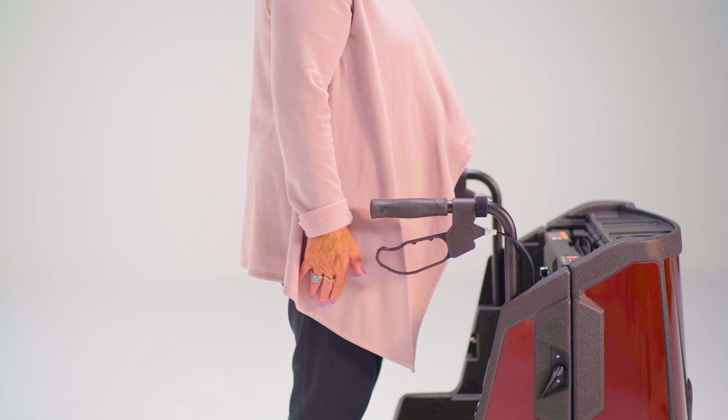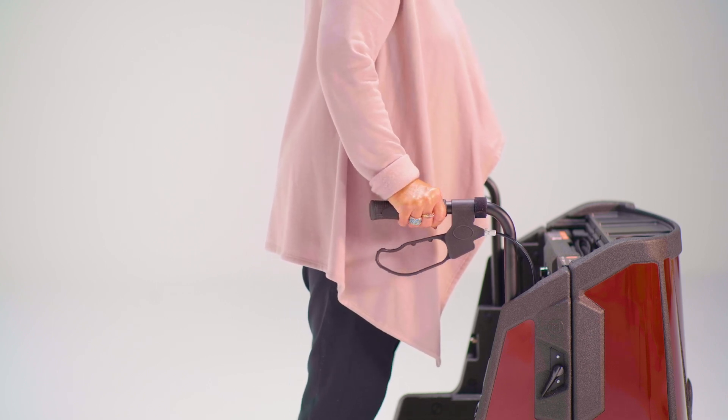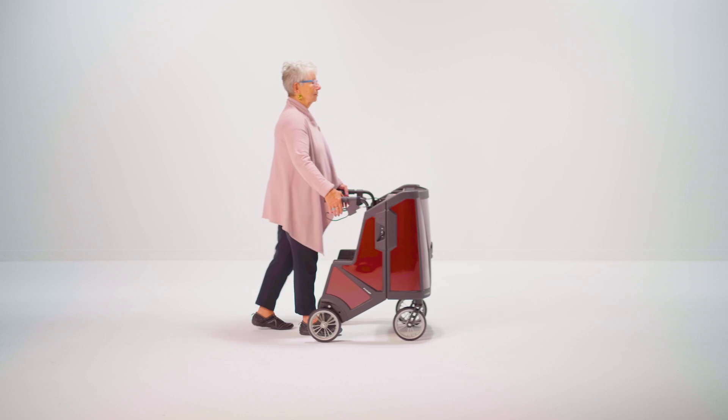That's it! You are all set to go! Each Motivo is factory set to function out of the box. If you feel you need to adjust the brakes, it is amazingly simple.